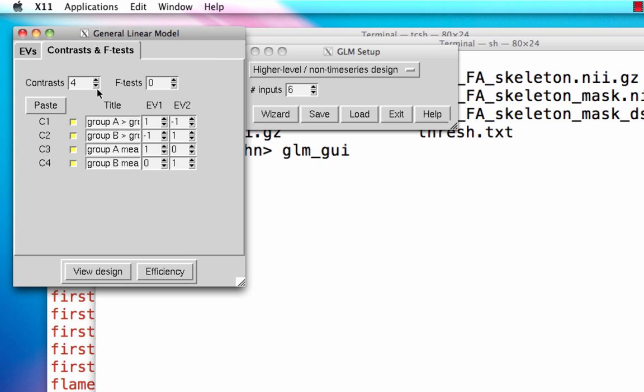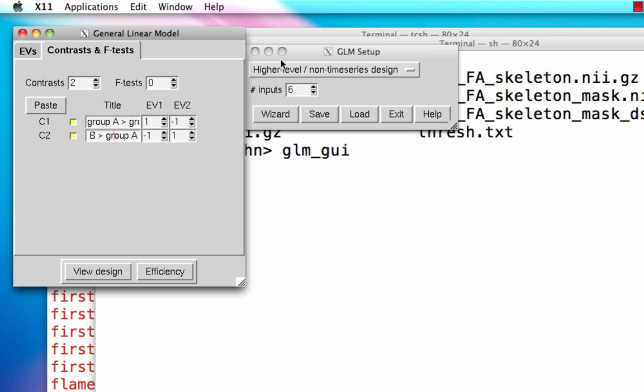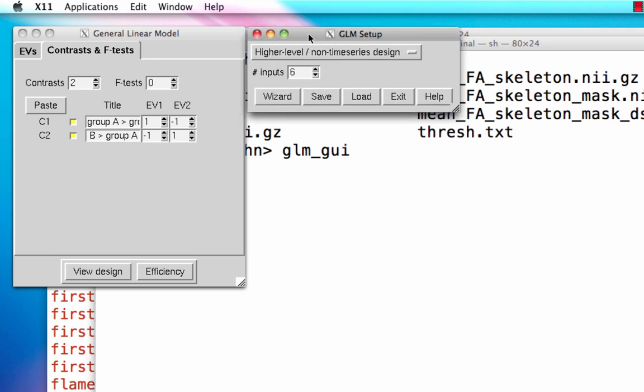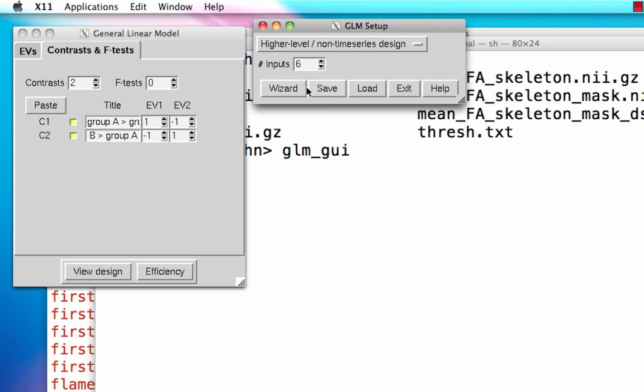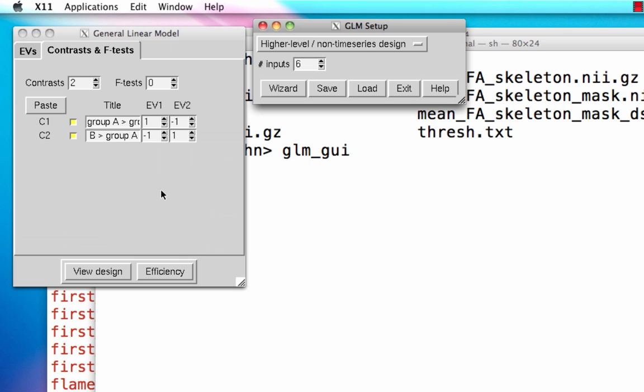Last thing here, go to contrast and just bring this down to two because we're not really interested in the group means for their own sake. Now this first contrast is going to be the younger minus the older group and then the second one is the older minus the younger group. You'll just have to make sure you know which subject belongs in which group before you carry this out. But that's the way they're set up. And we're going to save this out as design.